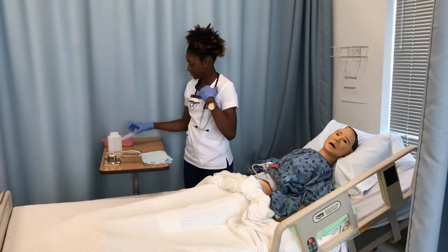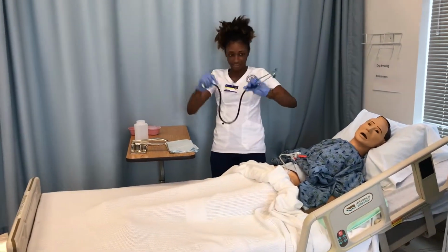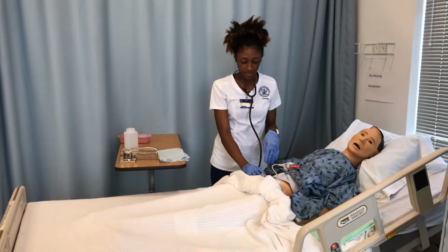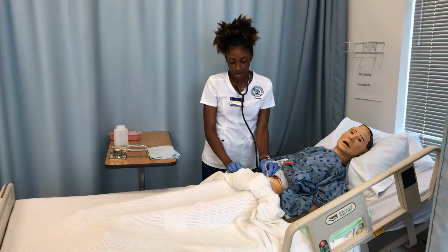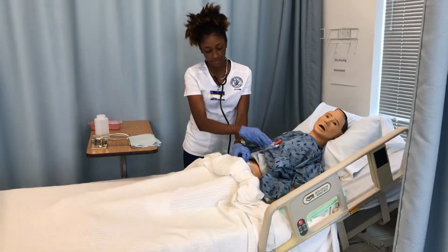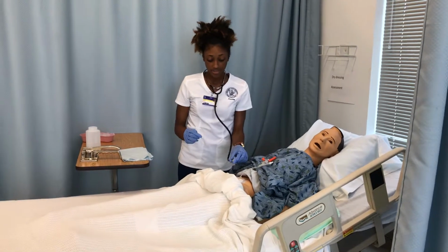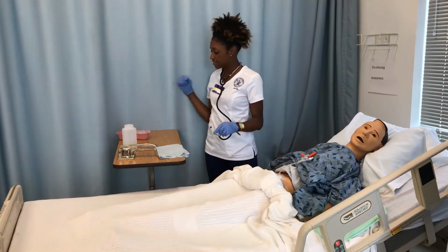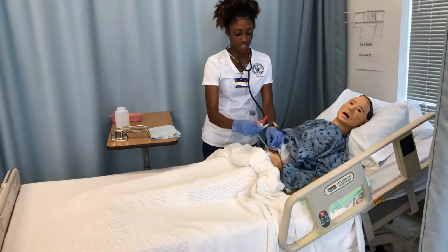Okay, first I'm going to auscultate, starting at the right lower quadrant, and then the right upper quadrant, the left upper quadrant, and then the left lower quadrant. I'll auscultate for a full minute. If I do not hear bowel sounds, then I'll auscultate for 5 minutes. While I'm here, I'm just going to go ahead and check for placement.